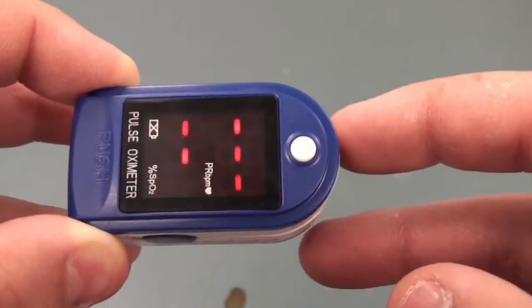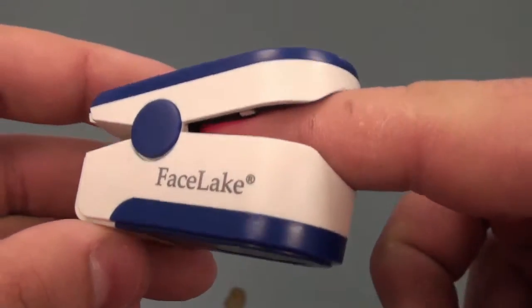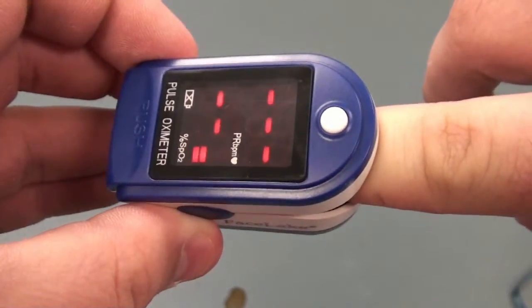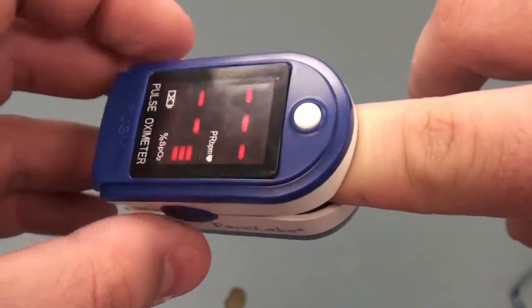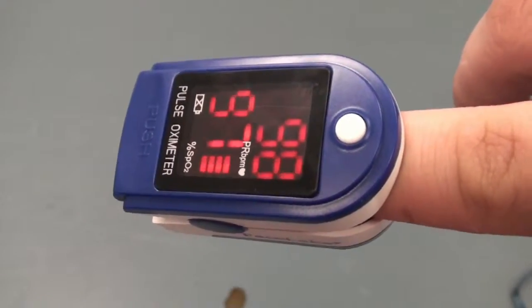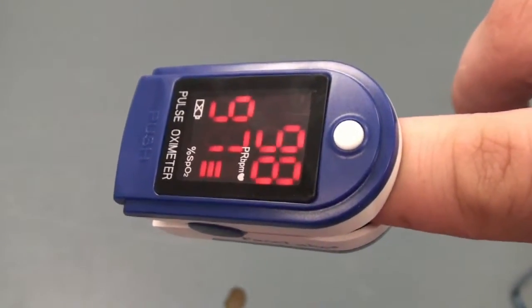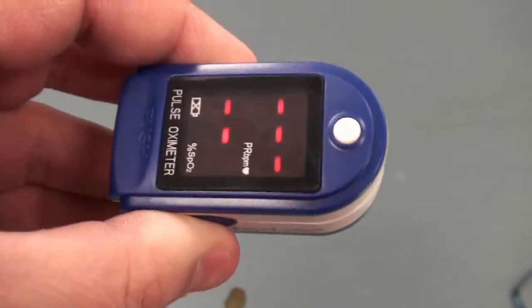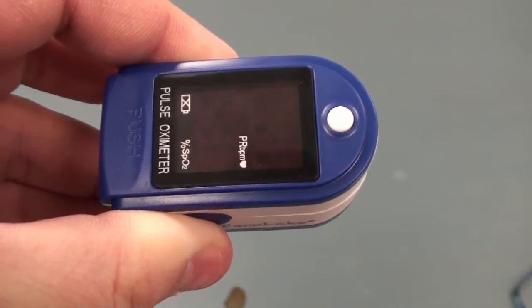Once the device is turned on, open the clamp and place your fingertip inside the probe. You'll notice that the SpO2 bar will start to fluctuate and will eventually show your pulse and your blood oxygen. If you take your finger out of the device, shortly after it will turn off to save batteries.